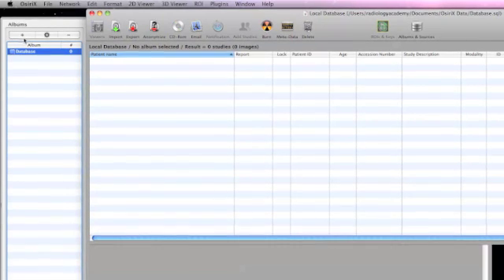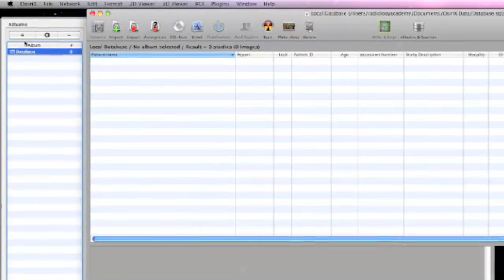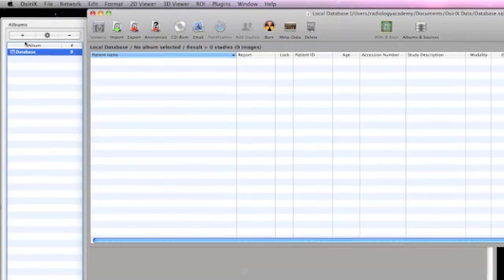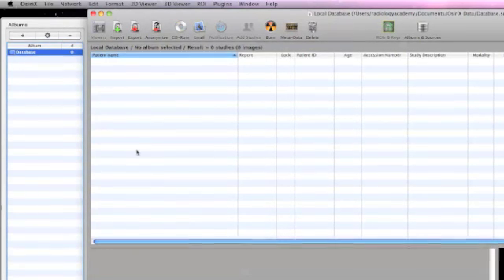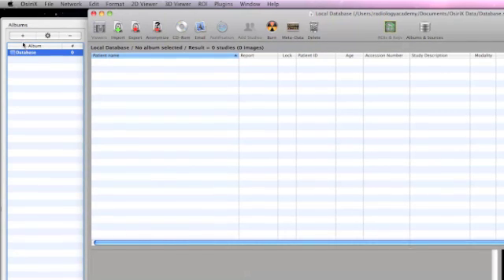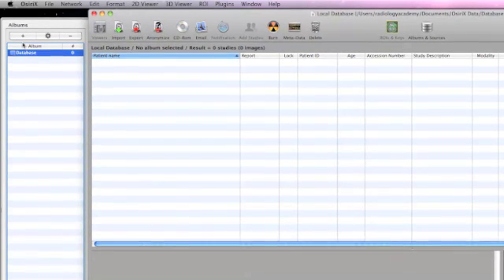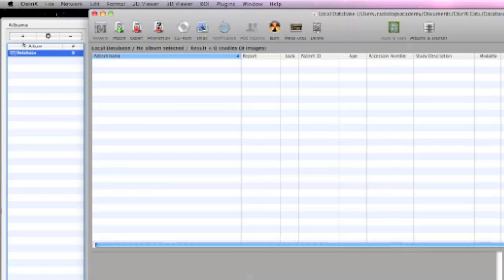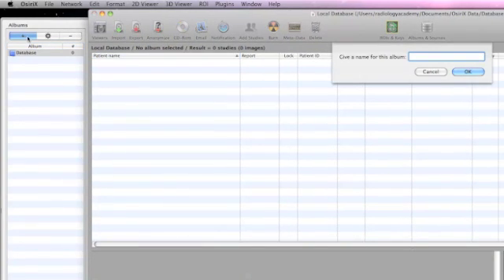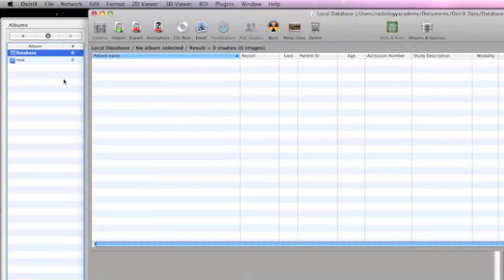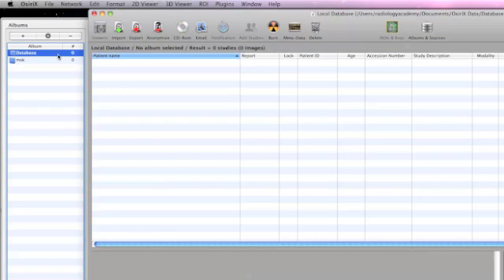It's very important that we add additional folders to the database so we can hold interesting sets of cases specifically. We can add these using the album folders. If we toggle on the positive icon, we can give a sub-album a name - in this case, MSK. Press OK. That creates a subfolder. Any cases currently present in the database can be dragged into the MSK folder by drag and drop, and those cases remain on the main database.